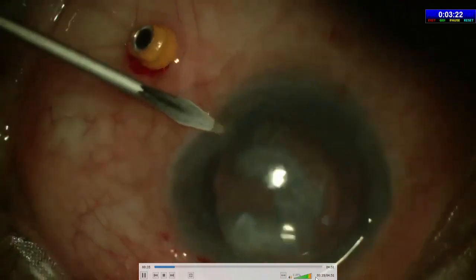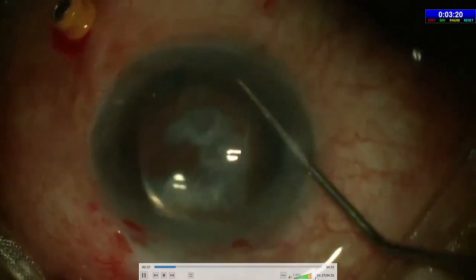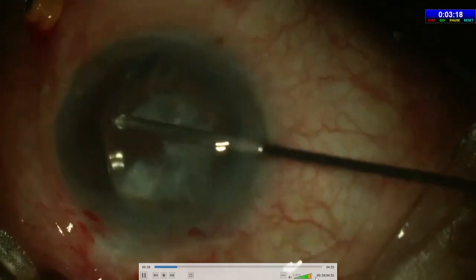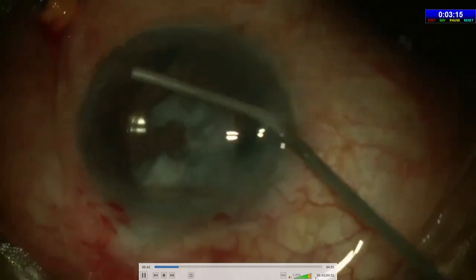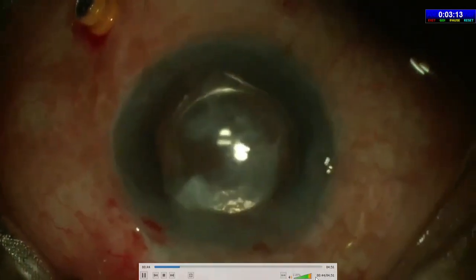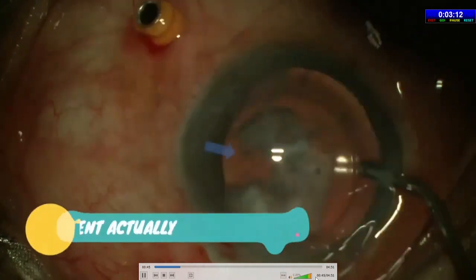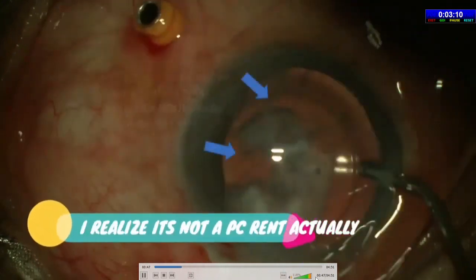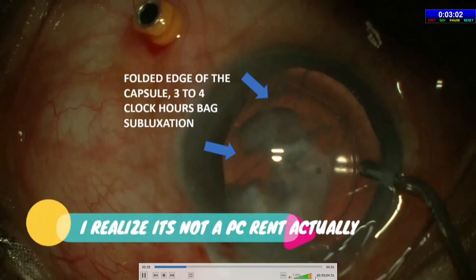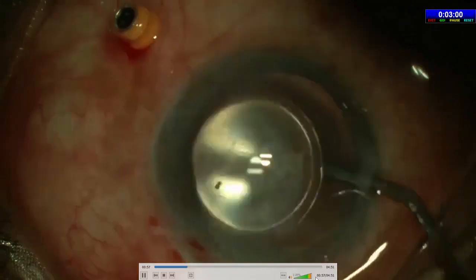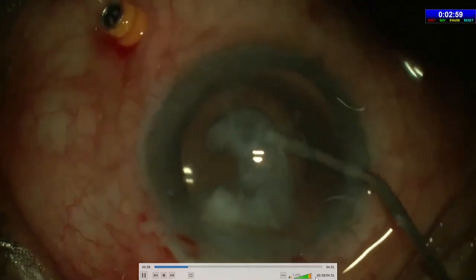I began with making a single pars plana port to clear some prolapsing vitreous from behind, making sweeping movements to push back vitreous strands causing pupillary peaking, then putting viscoelastic to form the chamber. From the look of this, I realized that there may not be a PC rent at all, but a folded capsular bag with three to four clock hour subluxation, with cortex still contained in the bag rather than anterior vitreous.